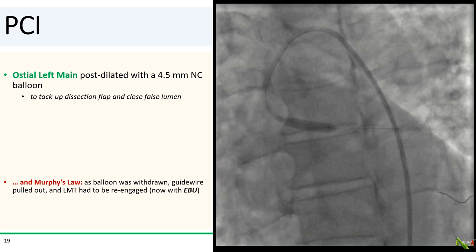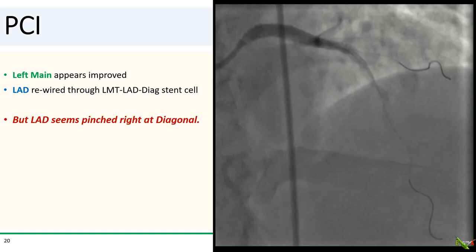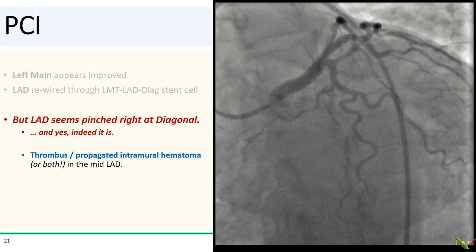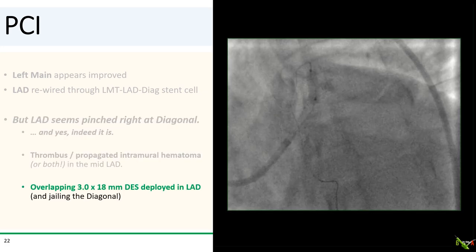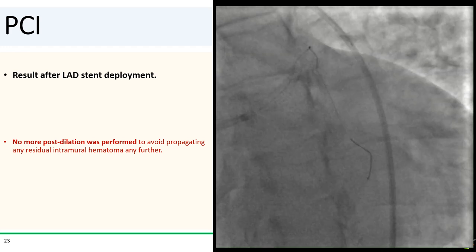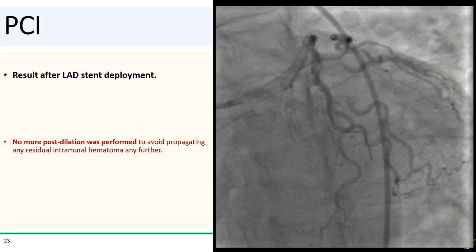The left main had to be re-engaged, but now that the vessel was stented, an EBU guide was used for better support. Angiographically, the left main appears much improved. The LAD was rewired through the left main–LAD–diagonal stent cell, but the LAD does seem a little bit pinched. And looking at it from the spider view, indeed the LAD is pinched off — there is thrombus or propagated intramural hematoma or a little of both in the mid-LAD. Another stent was going to be needed. After dilating the stent cell with a 2.0 mm balloon, an overlapping 3.0 by 18 mm DES was deployed in the LAD, now jailing the diagonal. Normal post-dilation was actually not done here to avoid propagating any residual intramural hematoma further down the LAD or diagonal.